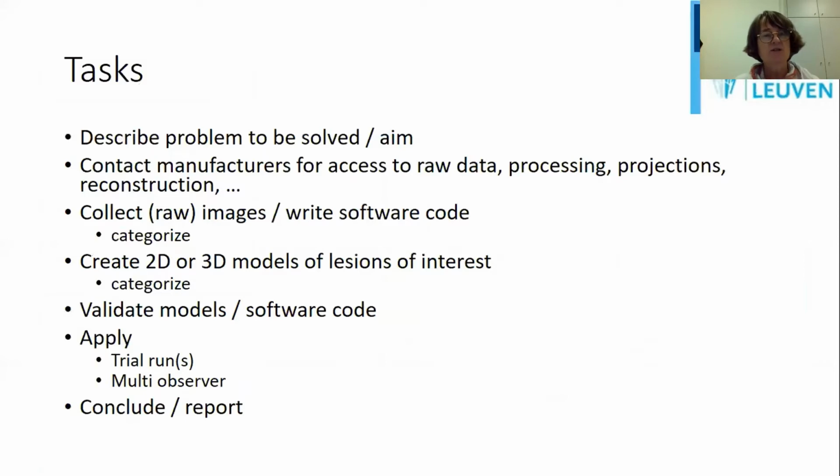Okay, so how do we start such a thing? What are the different tasks? First, you need to describe your problem, and in terms of physics, you may have to contact manufacturers, for instance, to get access to these famous raw data, or to get access to a processing routine to process the data, or to reconstruct the projections of a tomosynthesis set, for instance.